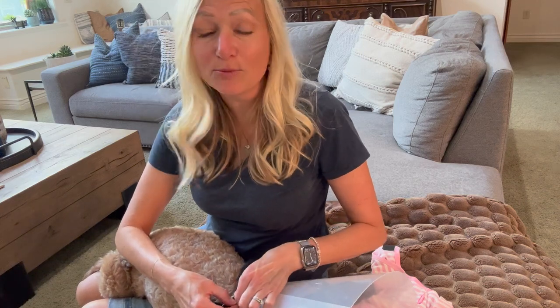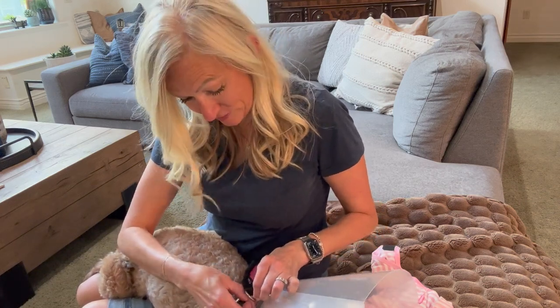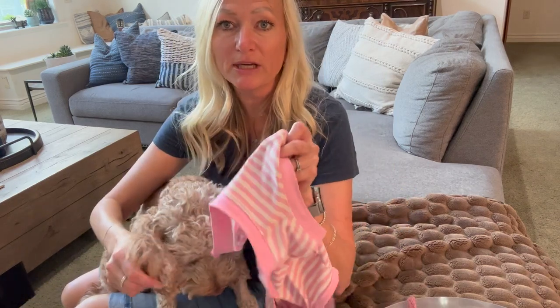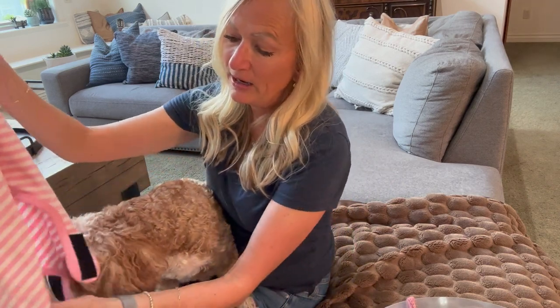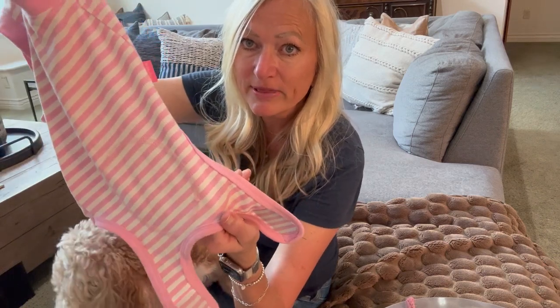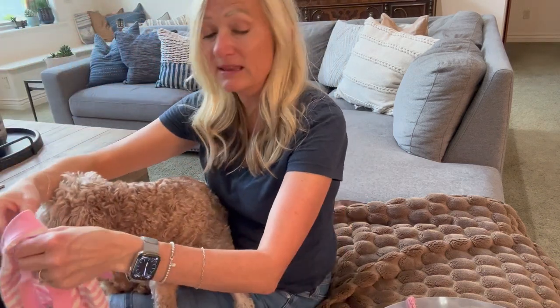It just looks like a really cute pair of pajamas for your dog. Coco's incision is right here, and what the surgery recovery suit does is cover that area — it's reinforced right there. We're trying to cover that area so she can't lick it and get the stitches out.